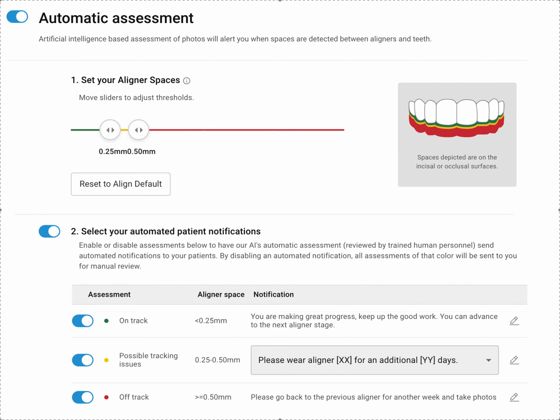And what an incredible, just to add, not only are you going to have fewer refinements if you do this, you're going to have happier patients, you're going to have fewer butts in chairs, you're going to have more revenue, you're going to save so much chair time, but also you're going to have such a cool network of photos going back every single aligner. You know what cool marketing stuff you could make with that? I mean, you could make like a flipboard video. My mind's spinning at what I could do with one of these if someone actually did this from A to Z.